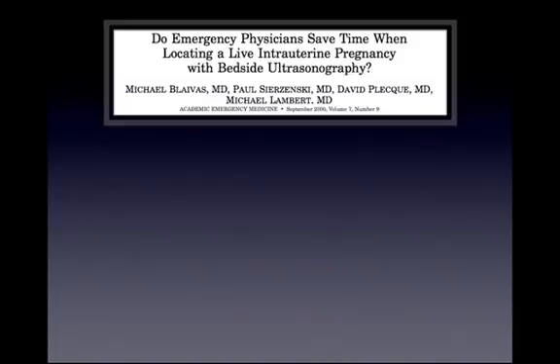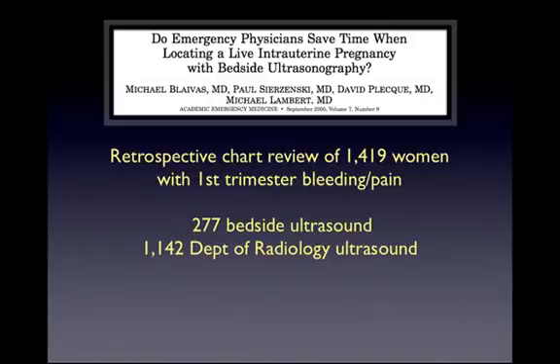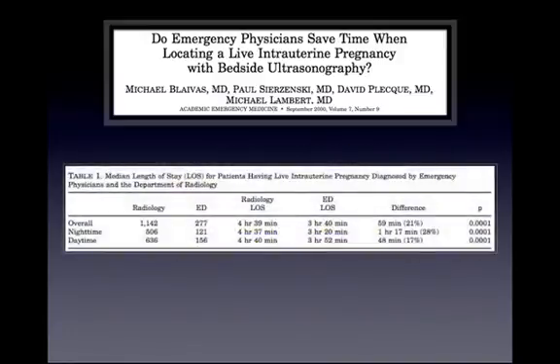So with increasing experience, physicians are able to reliably perform studies. But does this actually help with ED flow? Blavis et al. conducted a study in which they evaluated whether emergency physicians could save time when locating a live IUP with bedside ultrasound. In this retrospective chart review of 1,400 women with first trimester bleeding and pain, they conducted 277 bedside ultrasounds. 1,100 women went to the Department of Radiology for their ultrasounds.